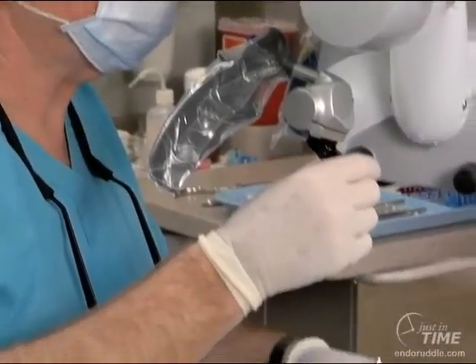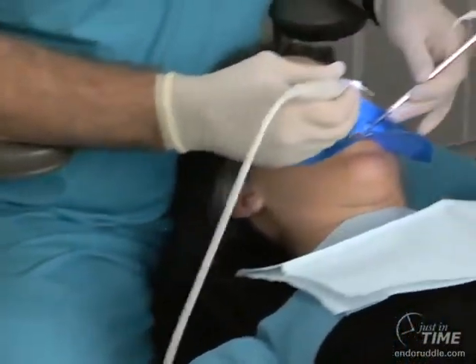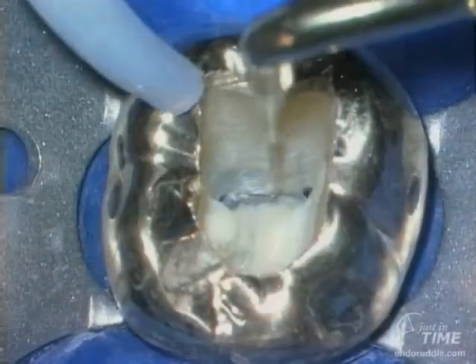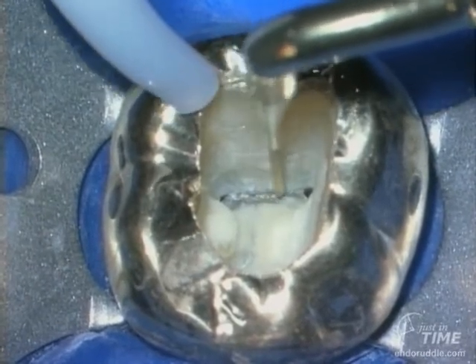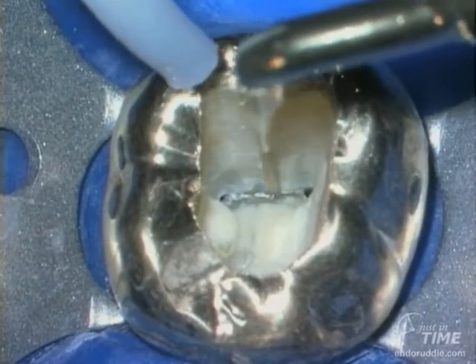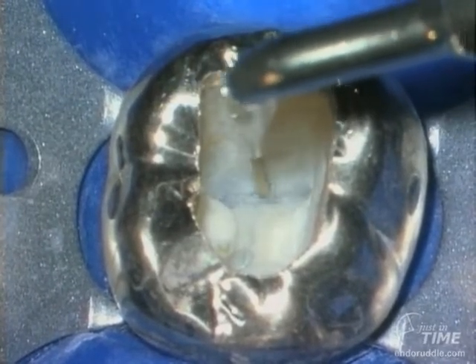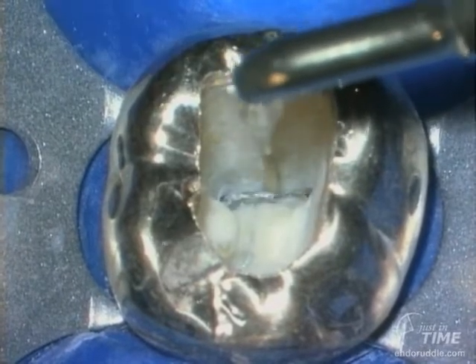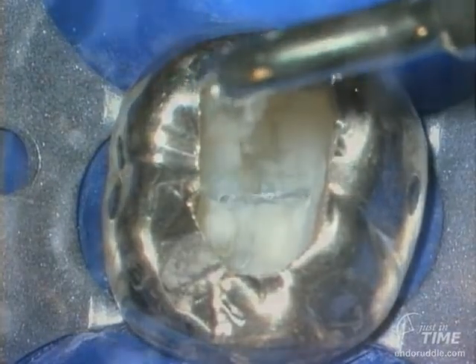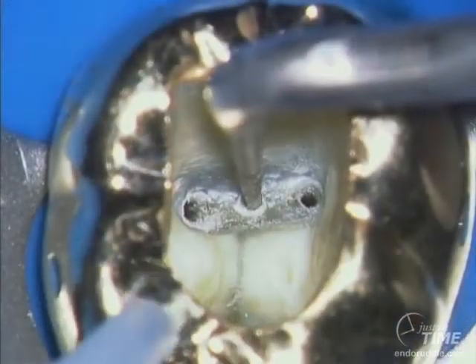Ultrasonic technology is playing an increasing role in access cavity finalization. Here we're using a Pro-Ultra tip, dry — the air blows out the byproduct of our sanding action, which is dentinal dust — and we run along between the MB and ML interconnector. Within this groove in mandibular molars, one can occasionally find a mid-mesial system. If we never explore for this, we'll never find it. When you have a mid-mesial, it's right against the depth of the furcal side concavity, so we must shape this canal smaller than we would prepare the MB and ML systems.